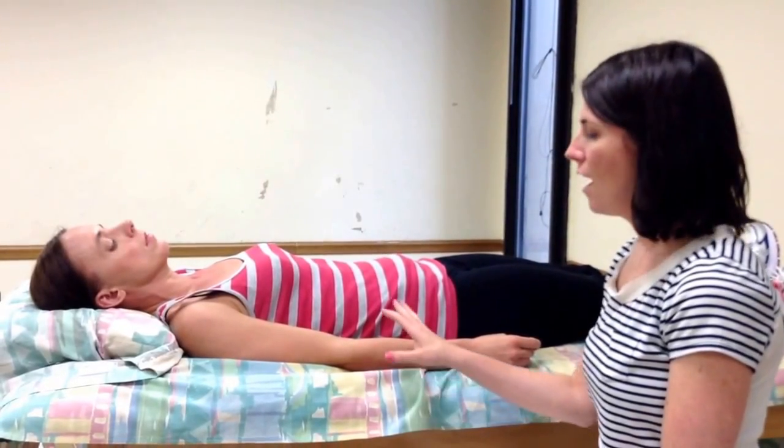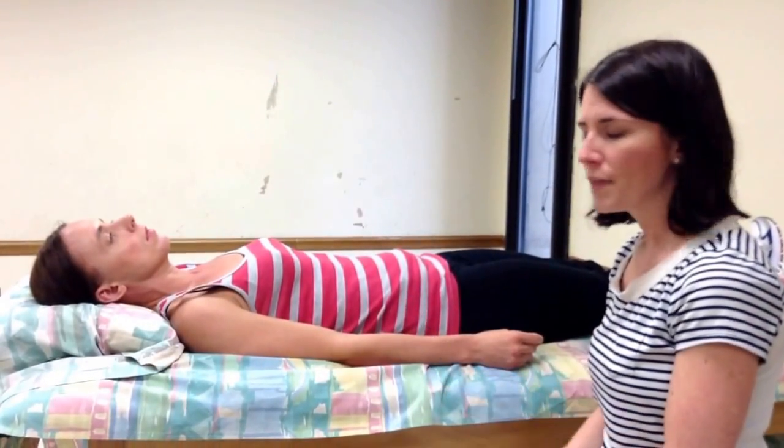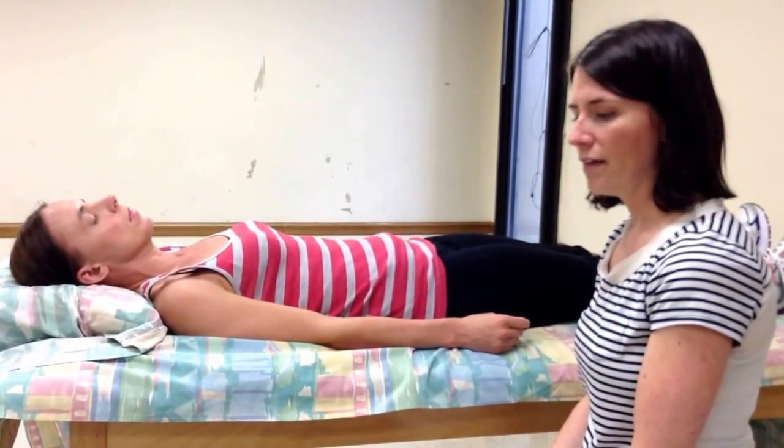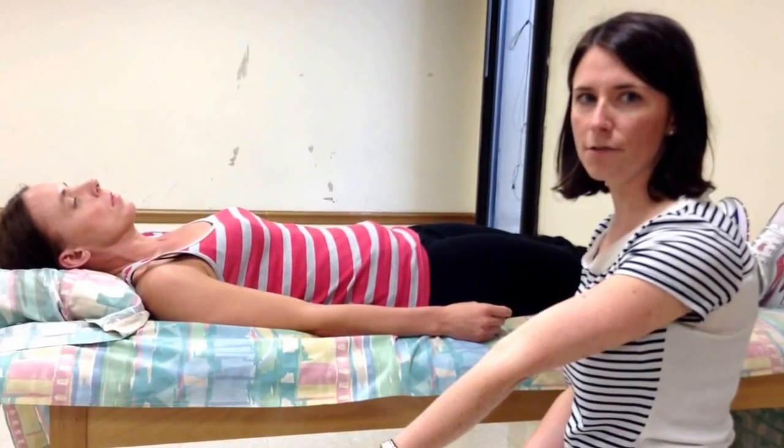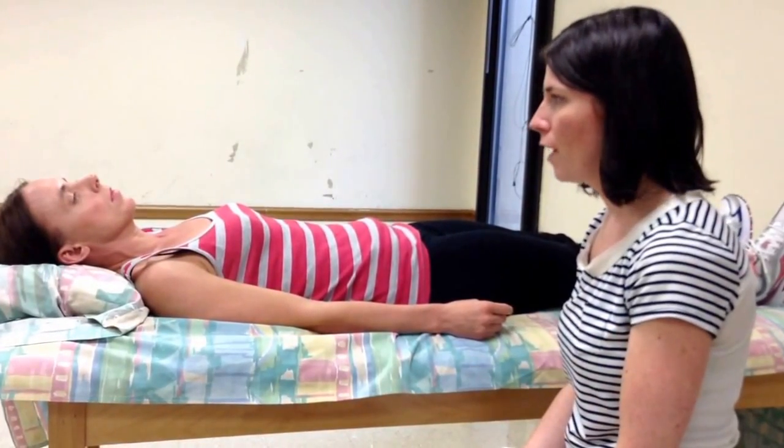In this video we're going to measure the elbow with our goniometer. Elbow flexion and extension occur in the sagittal plane. The end feel for elbow flexion is soft and for elbow extension is firm. The normal value for elbow flexion is 0 to 150 degrees.